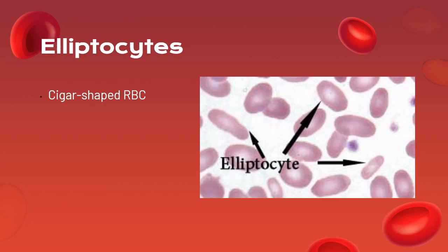That part is so thin that the cells get deformed, which is why it is not advisable to read there. That is why we have an ideal part of the smear where we read, because there you can expect that what you see presents your patient's status.